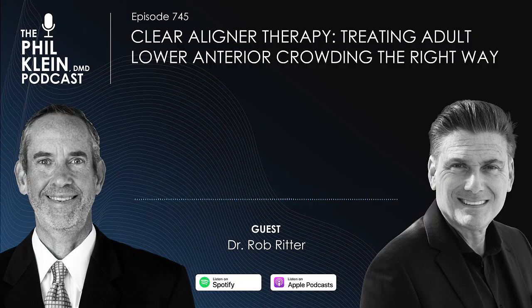Oh, I've got a great answer for that based on reality. So I had a woman just in that situation, and she was 75, Phil. 75. She had some anterior crowding, both maxillary and mandibular. And she talked to me about a couple of her upper front teeth. And I said, we'll just say Mrs. Jones, Mrs. Jones, I'd love to be able to fix those teeth for you, but I don't have any room to do it. And really, I think you have to go through some orthodontics first.